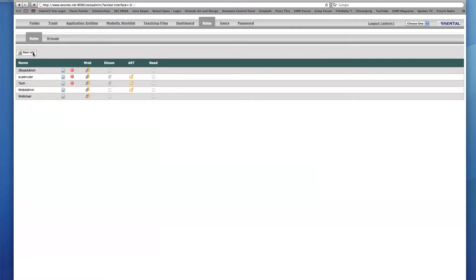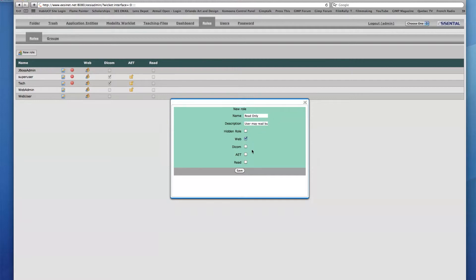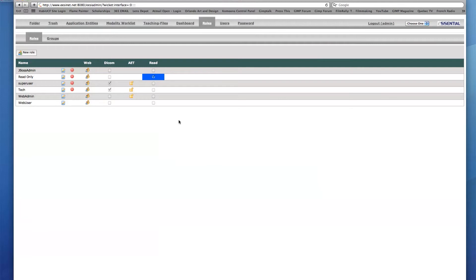Finally, I'll create a new role and name it Read Only with the description saying User may read but not write, edit, or delete. I will then enable the Web and Read role group checkboxes. As you can see, the Read column is now highlighted in blue indicating that this is a Read Only user role.